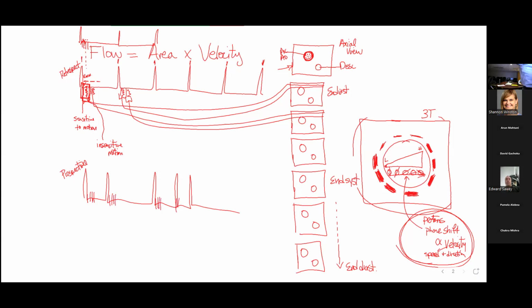What changes is diastole, so we measure systole the same, and so in AFib, there are nice published studies many years ago, 25 to 30, showing that you can measure flow very nicely with this technology. Now, there are, however, some caveats.